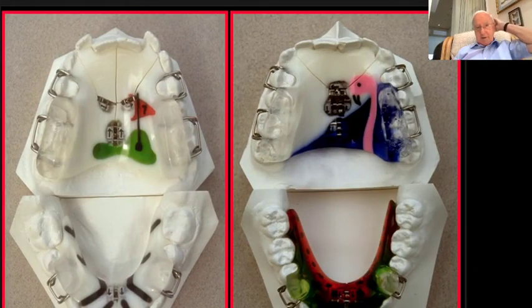This is the 3-screw sagittal on the left, designed for transverse and sagittal expansion. The midline screw is activated once a week for transverse expansion, and the sagittal screws converge to maintain contact on the central incisors as the arch expands. They may be activated twice a week to advance 2 or 4 incisors.